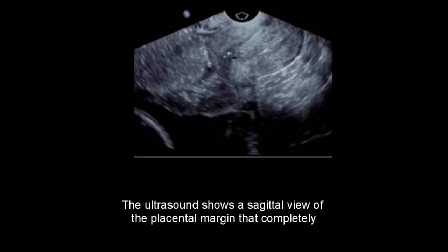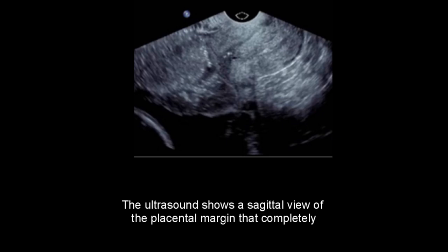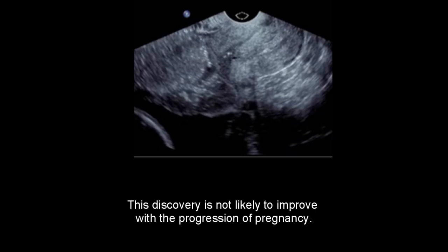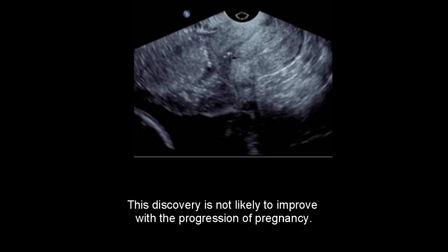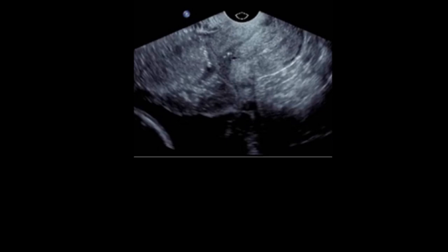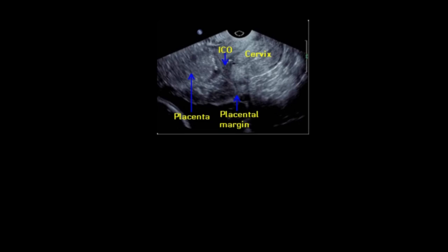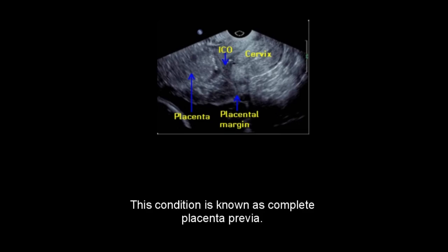The ultrasound shows a sagittal view of the placental margin that completely covers the internal cervical os. This discovery is not likely to improve with the progression of pregnancy. Therefore, close clinical and ultrasound monitoring is necessary. This condition is known as complete placenta previa.